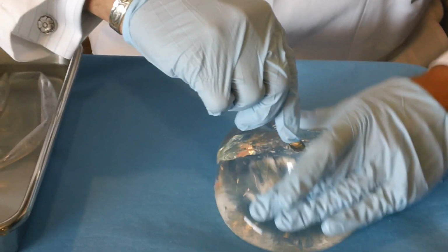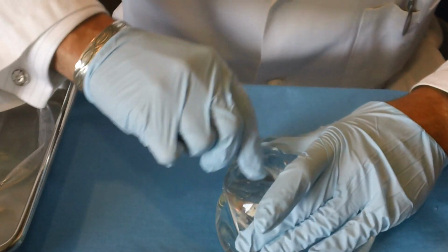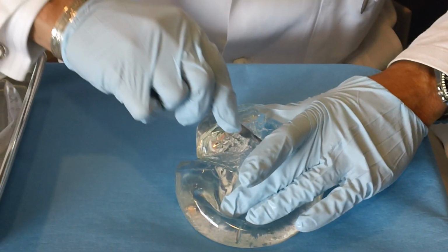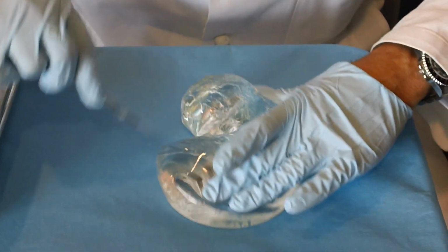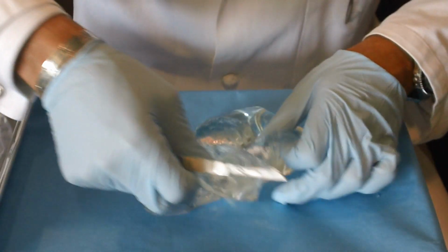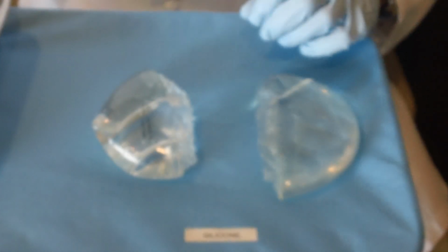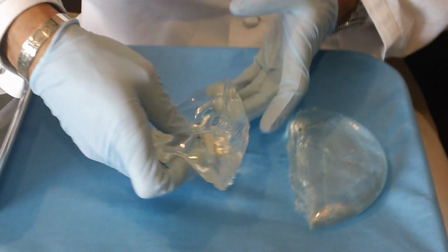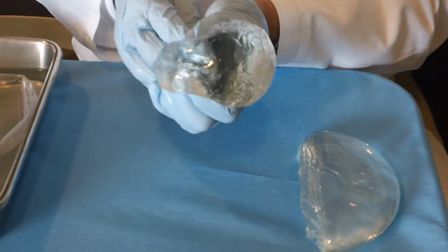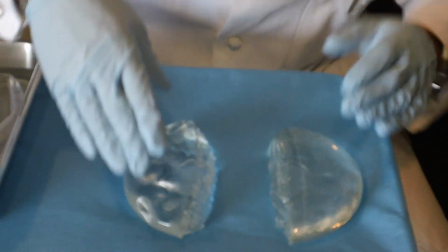Almost there. And it looks like it wants to run everywhere, but you'll see once I completely cut through this that we're going to have two complete halves here. And there we are. So you can see that the volume is actually maintained, and even the shape is maintained, and we have two halves of a silicone gel breast implant. So when I squeeze this, it's going to want to come out, but then it kind of comes back into the actual outer shell. So this is the difference between silicone and saline breast implants.